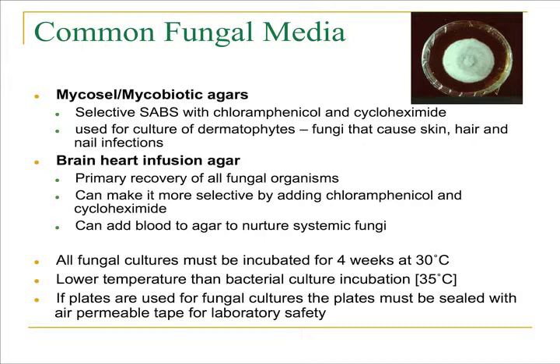Once you have your specimens inoculated onto one of these fungal medias, all fungal culture should be incubated for 4 weeks at 30 degrees centigrade. This is a lower temperature than you would normally think of for isolation of organisms. Bacterial isolation is done at 35 degrees centigrade, but the temperature of choice is 30 degrees centigrade for looking for molds and yeast. This helps nurture the mold form of the dimorphic fungi and overall works very well for the isolation of yeast and molds.